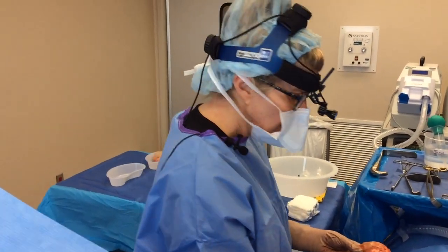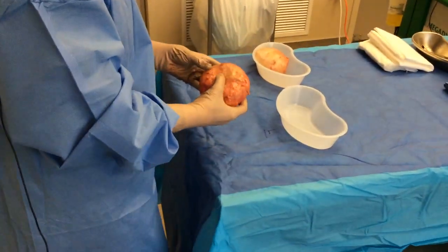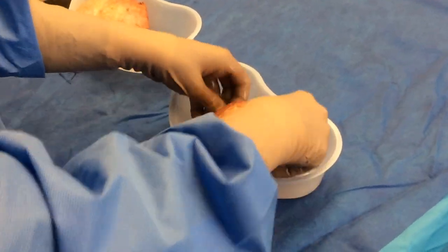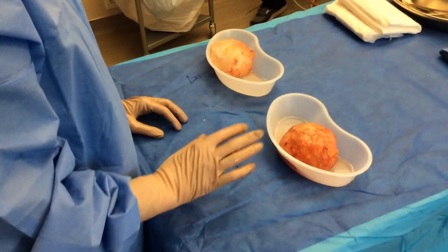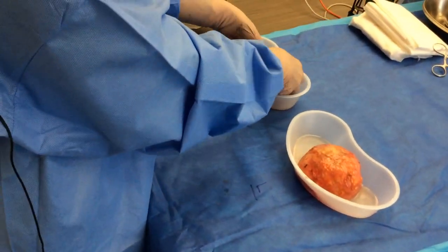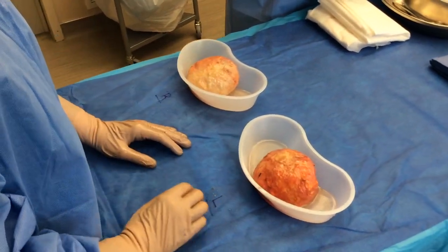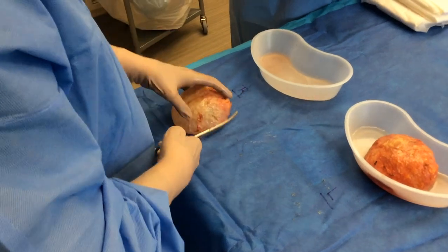You can see this is my back table. What I'm going to do after this is take off my gown and gloves and start fresh. This is her left side — I just finished it. This is her right side, which I had done previously. The difference that this is a little bit wider really doesn't mean anything. They're both taken out with no additional breast tissue, which is wonderful.